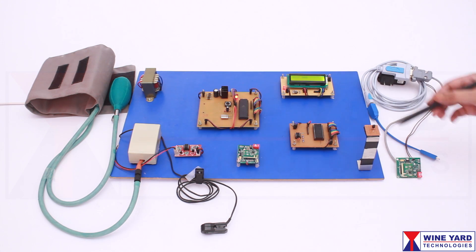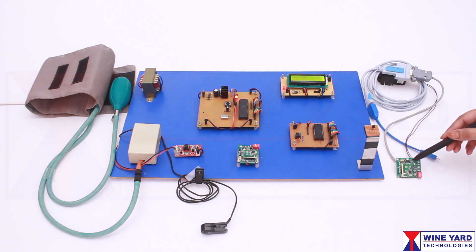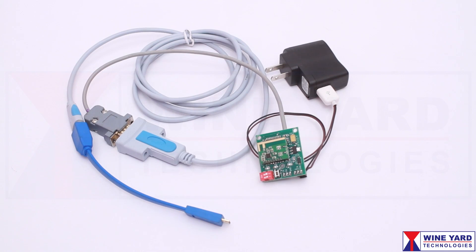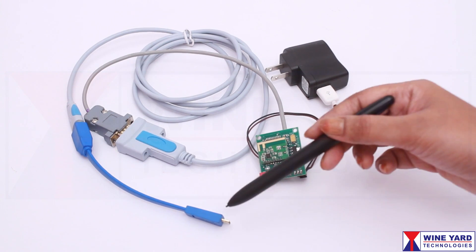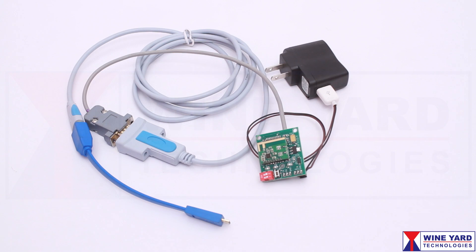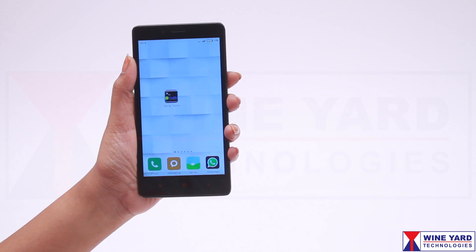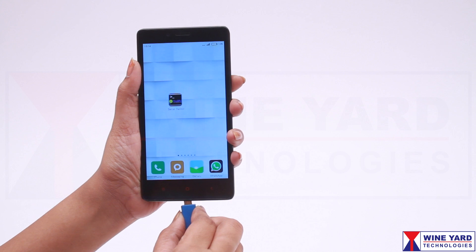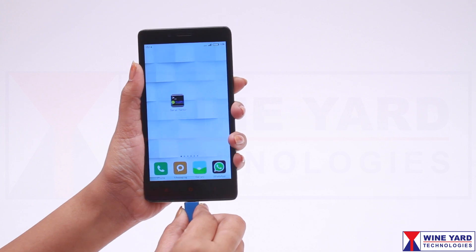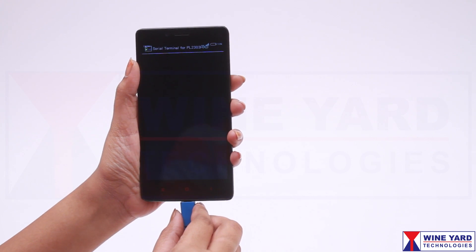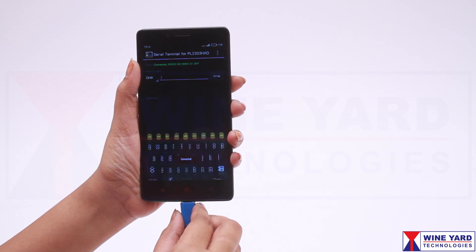This CC2500 Zigbee RF module is configured as a receiver. Here I am using a USB to UART connector to communicate from the USB port of any laptop. You can also communicate through any Android phone instead of a computer or laptop for easy demonstration.